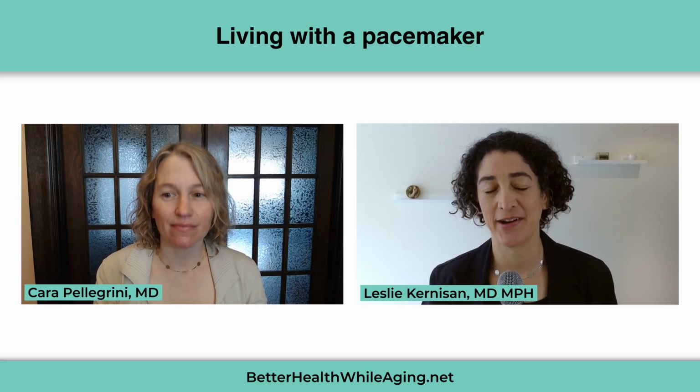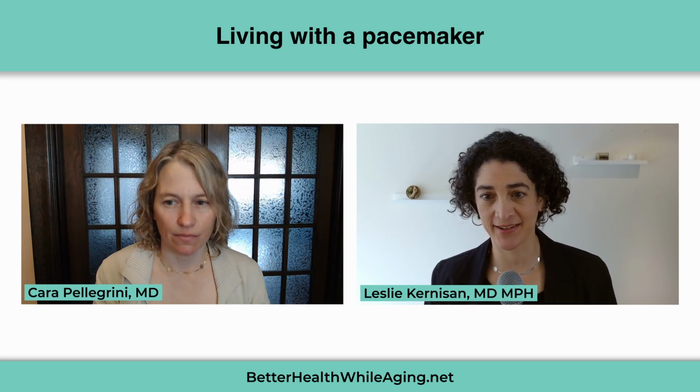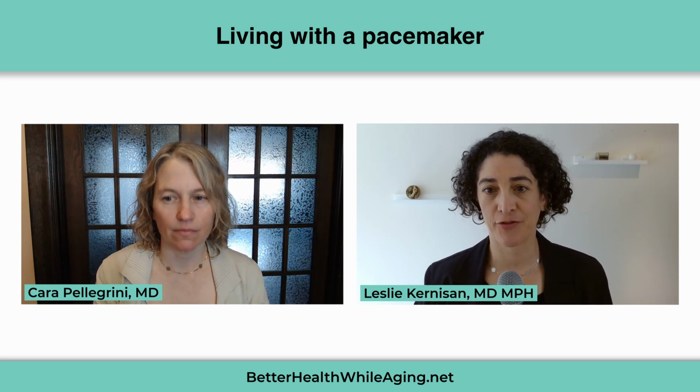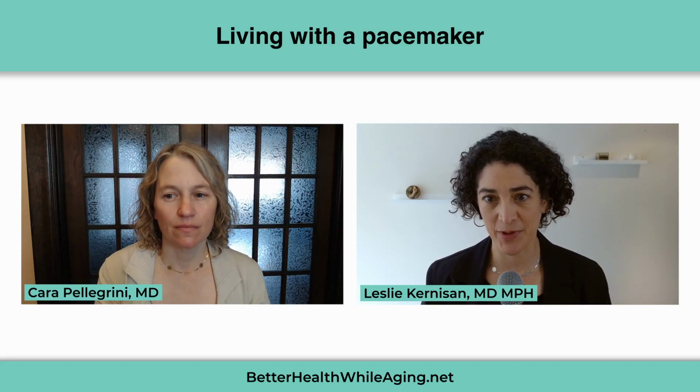Okay. And can you tell us a little bit more about what it is like to actually live with the pacemaker? I mean, you were saying that afterwards you can be near household appliances. It's probably better not to hold your phone there, but I would love for you to speak to, first of all, what kind of maintenance and care they need, in terms of the battery or other monitoring, and how they get checked and adjusted, and then any restrictions, like when people go through airports or other things that might come up for people who are living with a pacemaker.